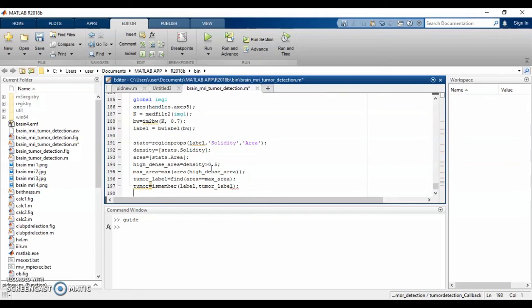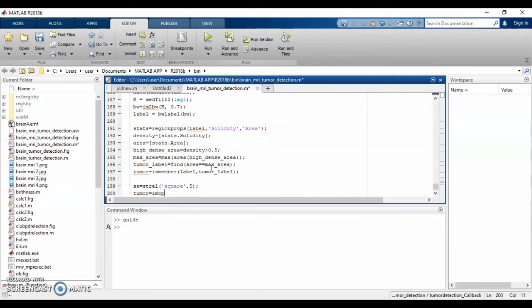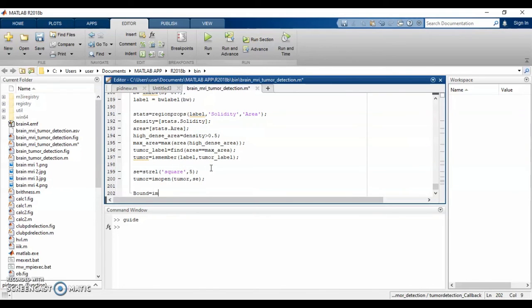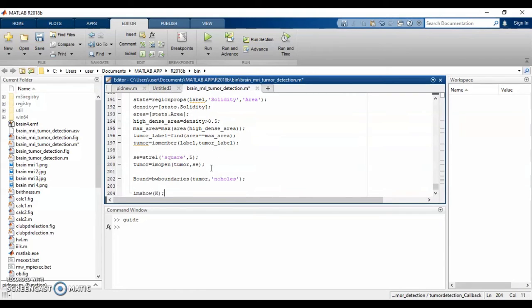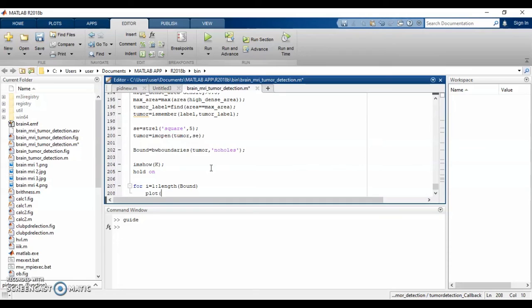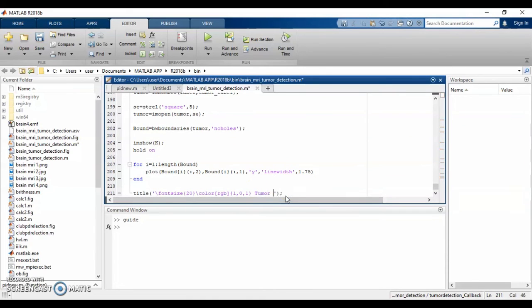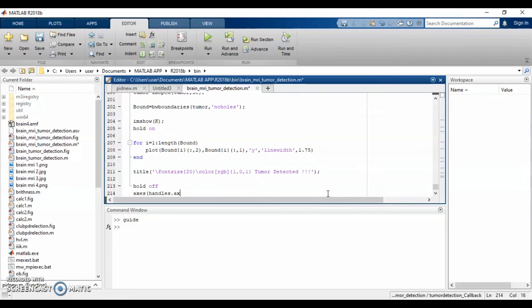So here is the script for thresholding. And next, to better detect the tumor, we need to use a morphological operation, which is the opening operation in this case, to define the shape of the tumor. And we then need to use the bwboundaries command to trace the border of the tumor. Coordinates returned by bwtraceboundary will then be used to plot the border on the image. So we will then label the image as tumor detected, and we will put it in axis 5. We will then run the program.